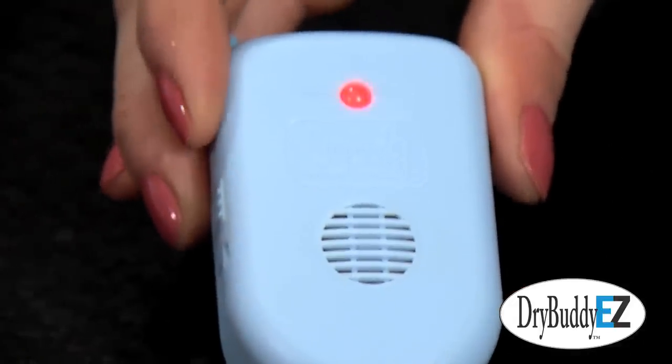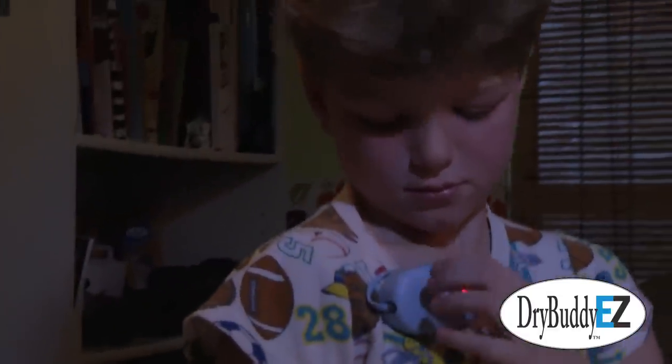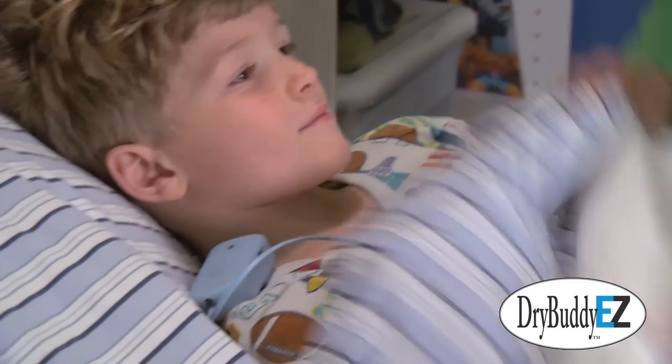You can assist and teach your child to clean up and reset the Dry Buddy Easy. This repeated waking when wetting gets your child to learn and recognize the symptoms of a full bladder and wake up before wetting.